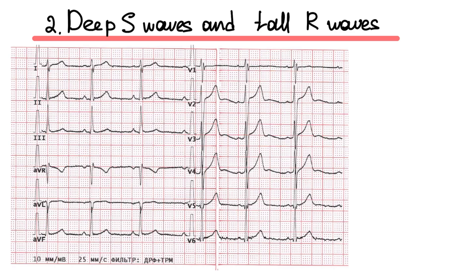Deep S waves and tall R waves at chest leads — we often see these ECG changes in young people. And of course, when we see this ECG, we might think about left ventricular hypertrophy. But it's not — it's a normal ECG. We use hypertrophy voltage criteria only for people older than 35 years old.